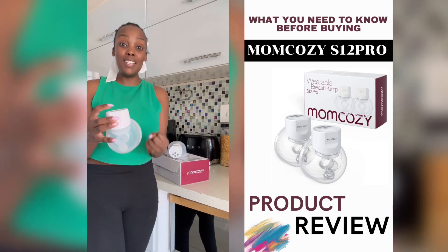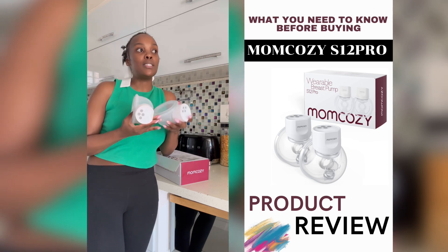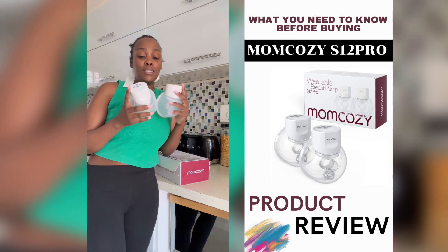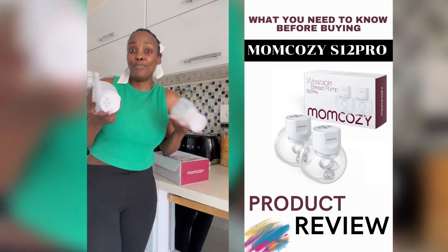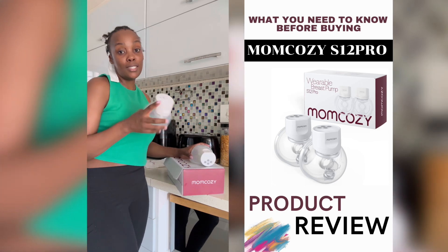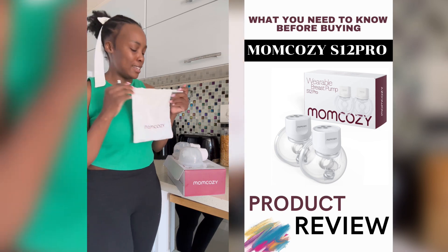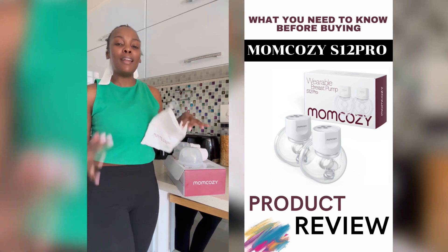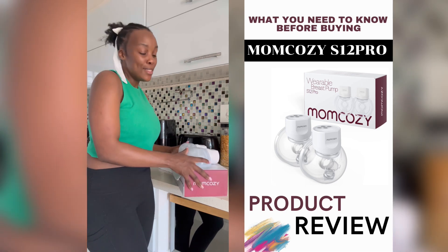It really draws the milk out well, and it's awesome. I'm happy with it — it's very comfortable and very versatile. I can get things done while pumping, which I love. If you're looking for an option, I think you should consider these. It's a really lovely brand; I love how they package their products — very feminine. Well done, Mom Cozy!